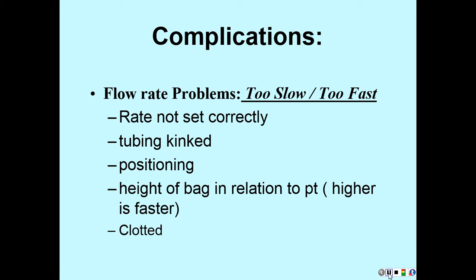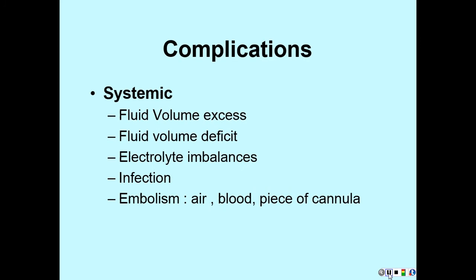So in the case of your peripheral IVs, rather than putting the streptokinase and all that business down through there, you usually just take it out and you start another one. Okay, now central lines may be a little bit different story, but again, that's not your call, that's the physician's. But if it's just a peripheral IV, nurses usually just take them out and start them in another place. All right. No irrigation.